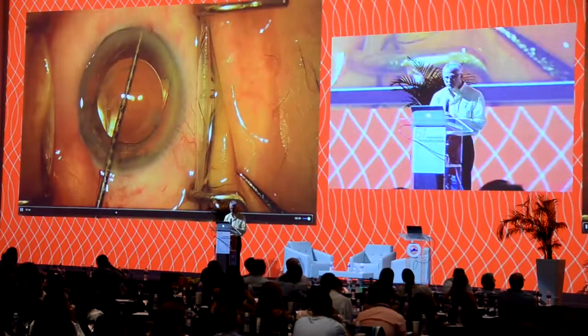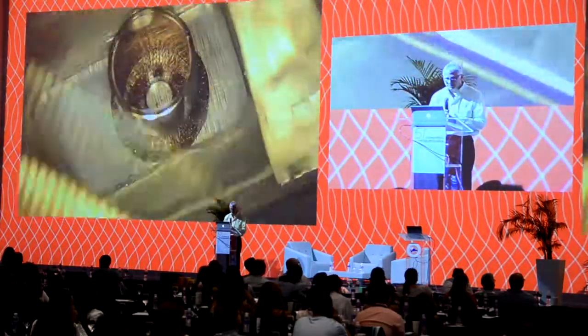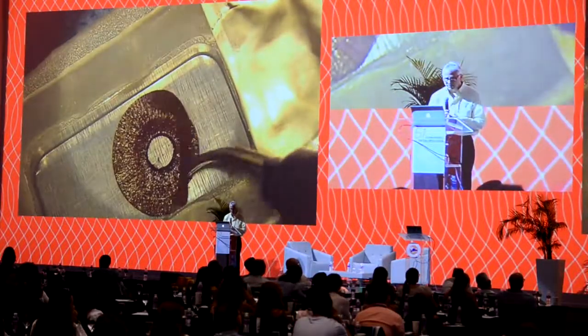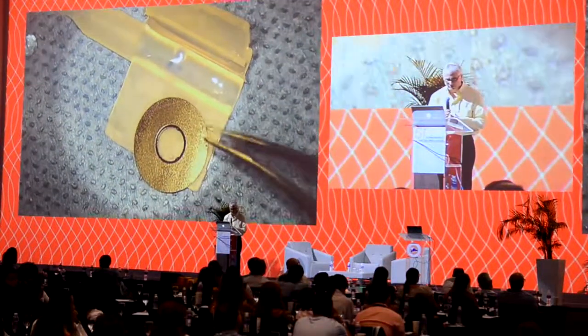Now we're going to measure the capsular bag. We're measuring it with an intraocular ruler. MST makes this instrument. And we're actually sizing it for a custom iris prosthesis made based on a picture of the fellow eye. We're trimming it to the size of the capsular bag. The outer part we give as a little souvenir to the patient. The inner part is what we implant.